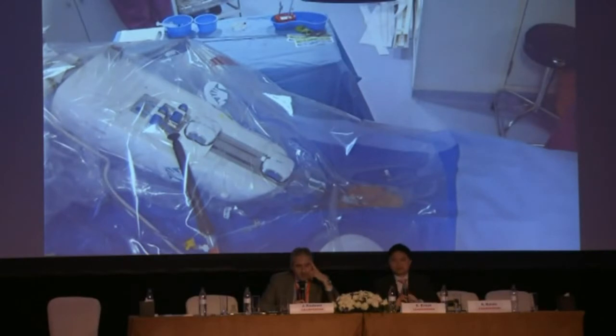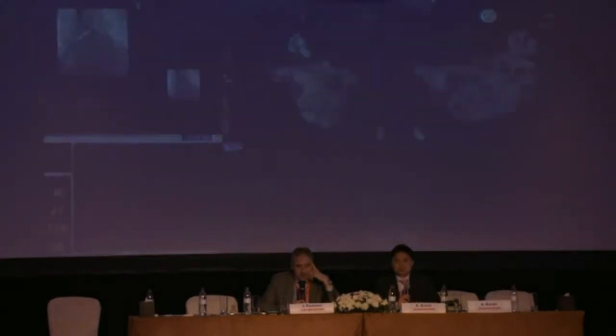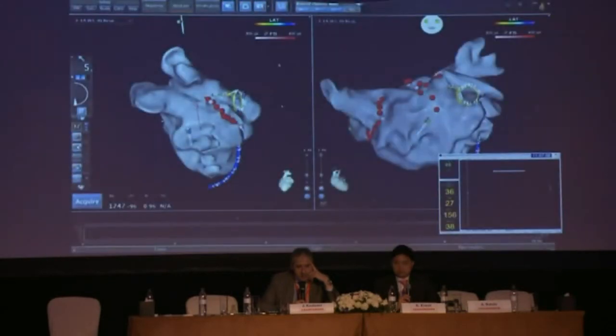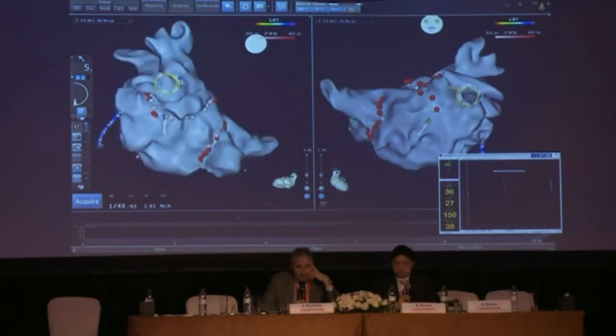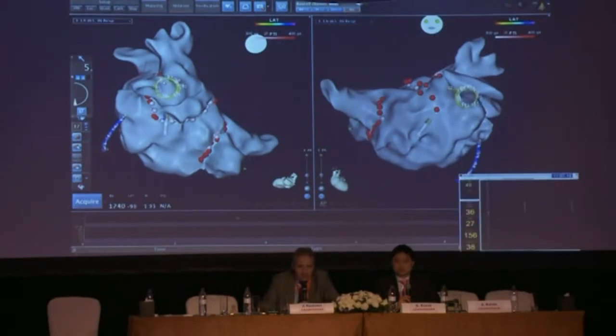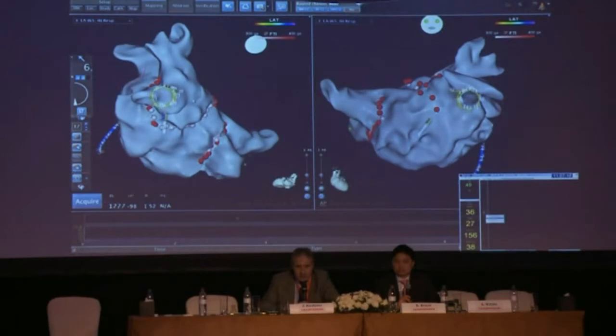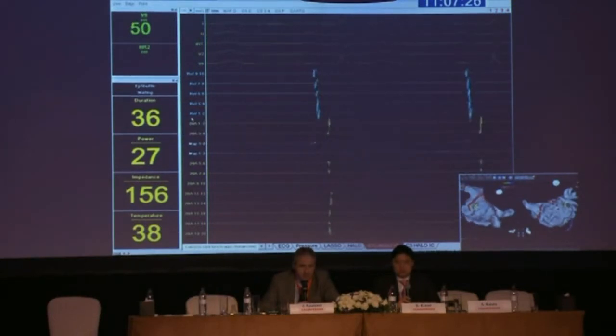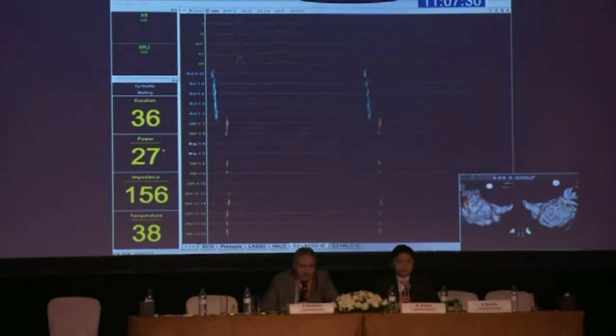If we look at the signals now, guys, we can see that I've moved into the left pulmonary vein, and that's reconnected. So there is still a little bit of work to do to really get that completely isolated. The earliest PV is 5.6 probably. Can we see down at the signals bottom end now, please? Do you pace in the CS to see better, or do you just rely on sinus rhythm? I think now it's so late, isn't it, that there's quite a clear distinction between the far field and the local, but I don't think that's going to be necessary.